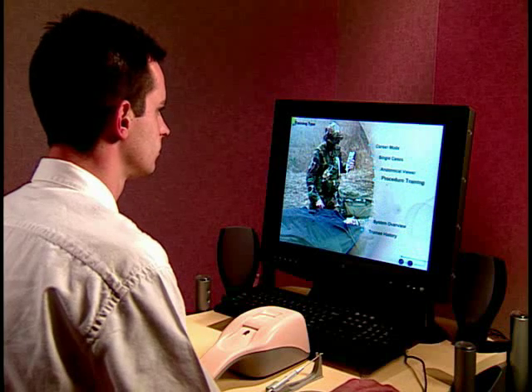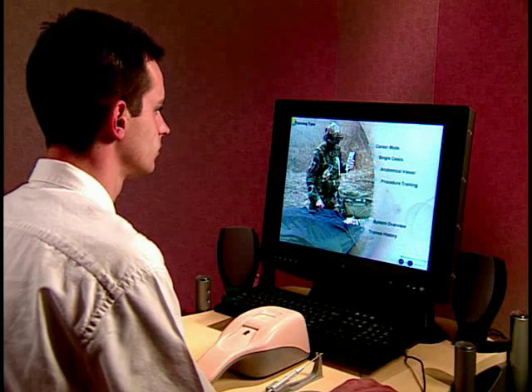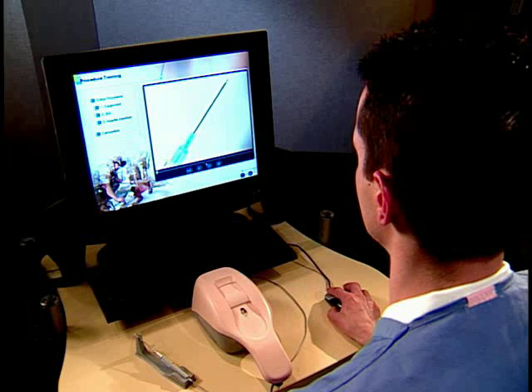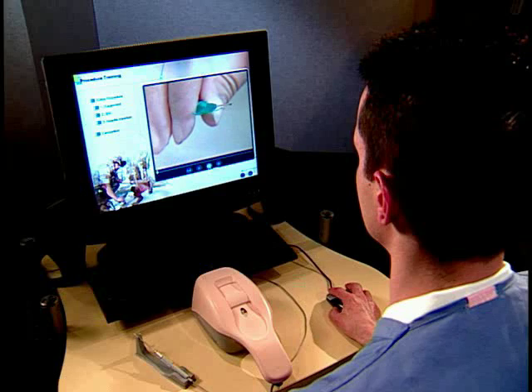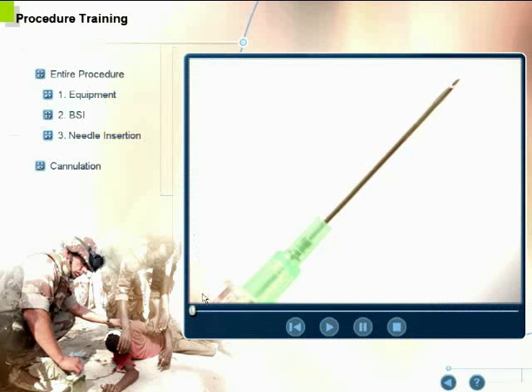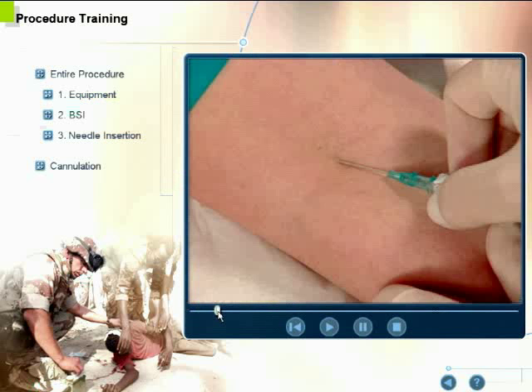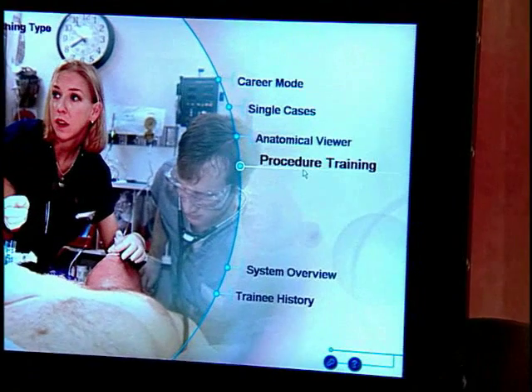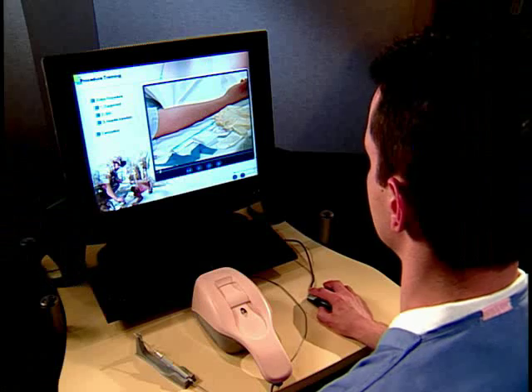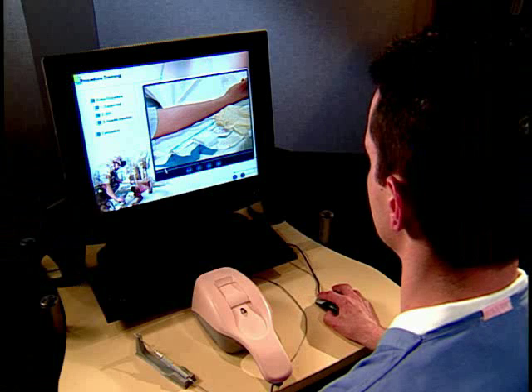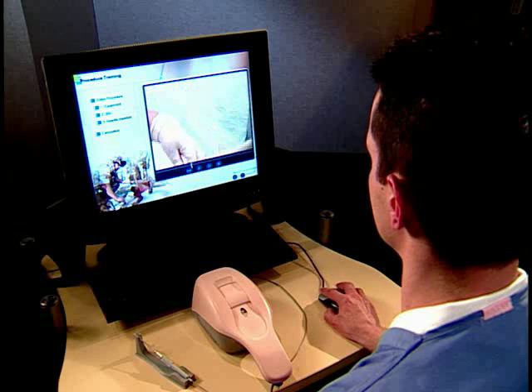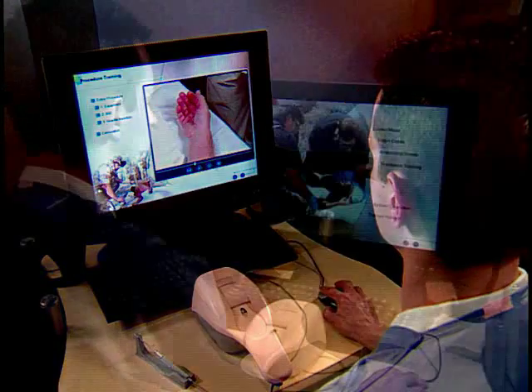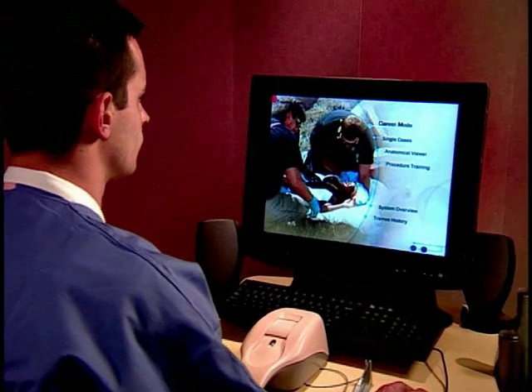The Virtual IV offers four training types: procedure training, anatomical viewer, single cases, and career mode. If you are unfamiliar with the intravenous catheterization procedure, or if during training you desire to review correct IV insertion technique, select procedure training. The procedure training screen allows you to view didactic educational videos about the catheter insertion procedure.